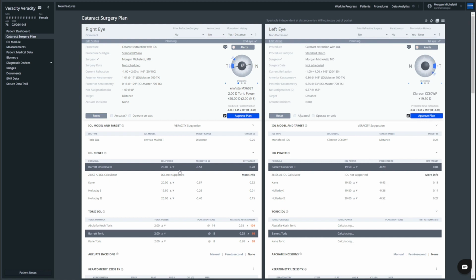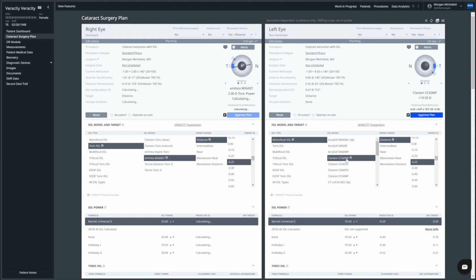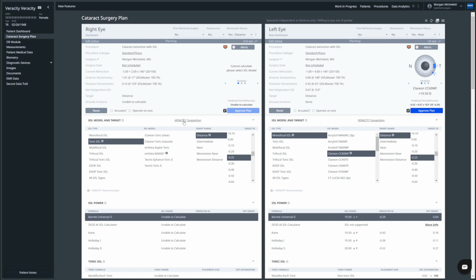But let's say this is a patient who comes in and wants cataract surgery with you. Now, this is already suggesting different lenses here, and it will suggest that based off of a lot of times you can integrate a survey. Here I don't have a survey integrated. It is something that I have used before, where you can have patients scan a QR code that's custom to them.